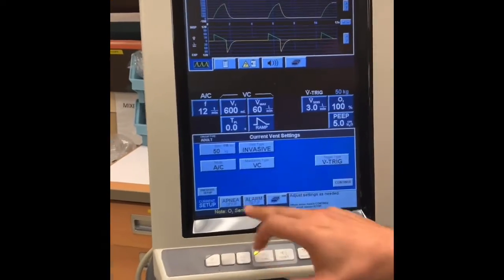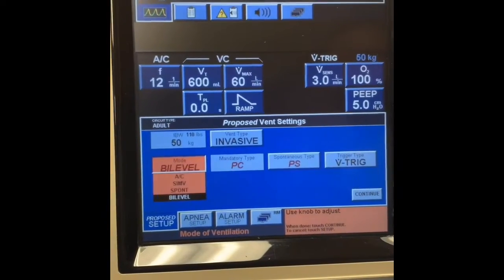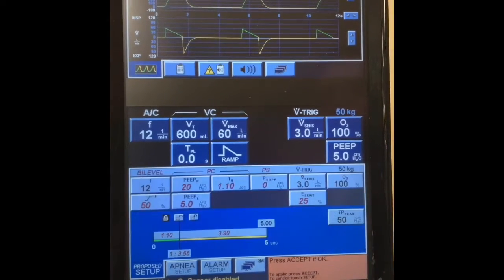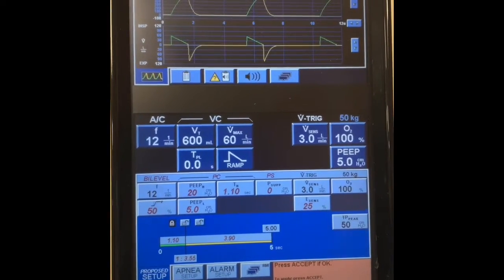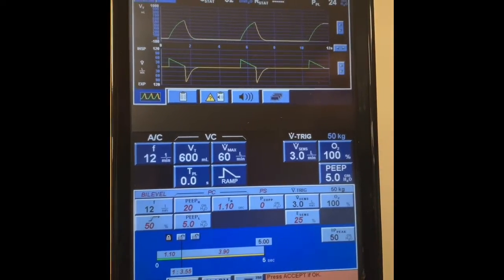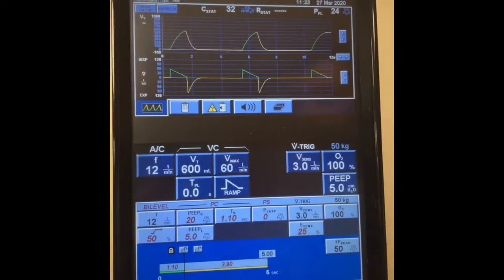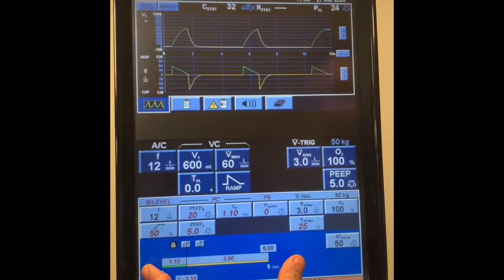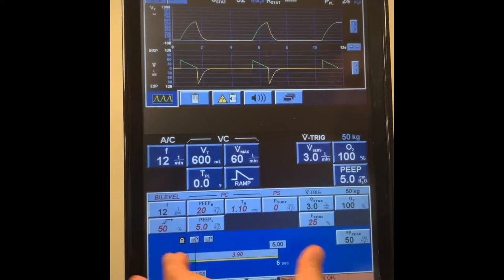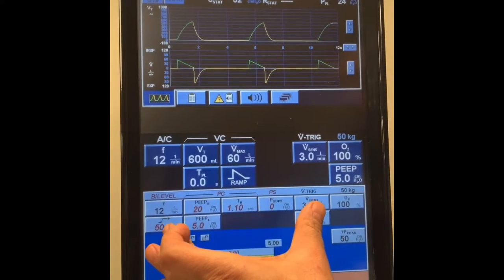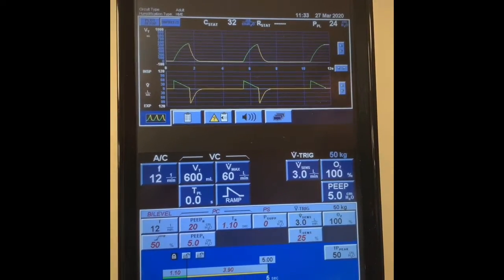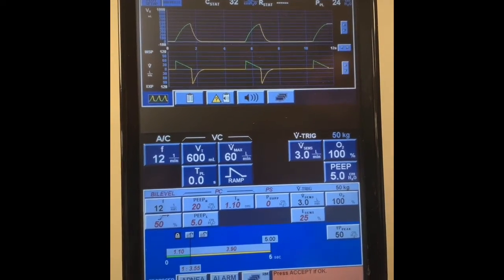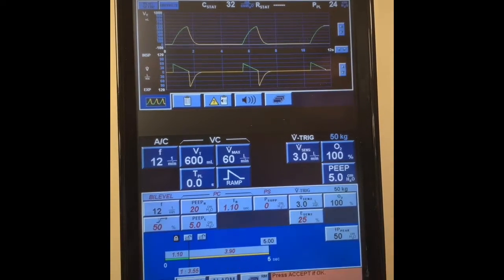To get started, go to your settings and select bi-level. Bi-level is a pressure control mode and it is spontaneous. When setting bi-level, you have to understand the rate is a release rate — all it does is lock your total cycle time. When you manipulate the IE ratio, that cycle time will always be the same. It's not a respiratory rate you can adjust for CO2, unless the patient is paralyzed, in which case it becomes your respiratory rate. So the rate: 10 to 12.